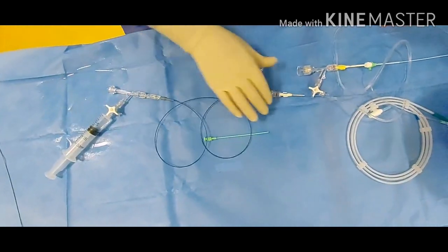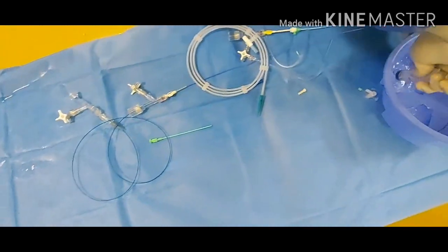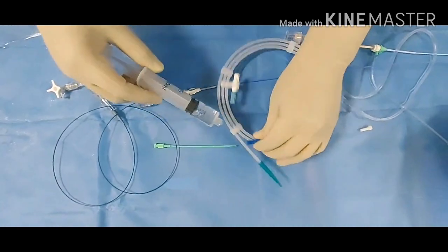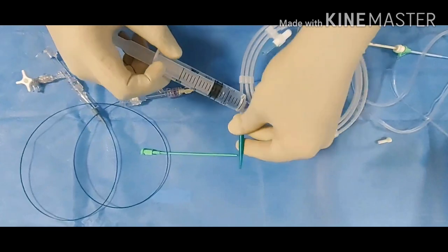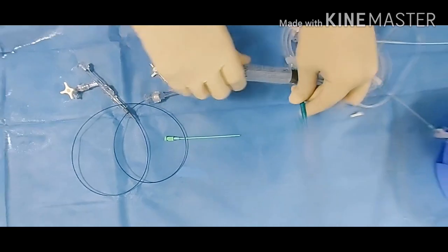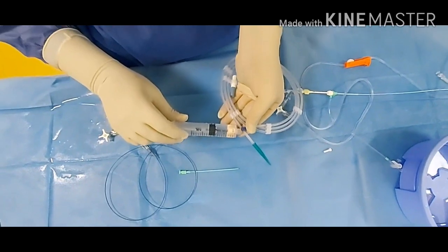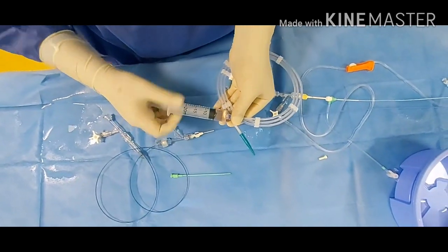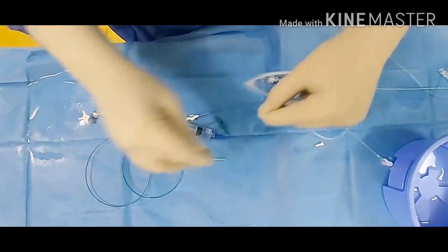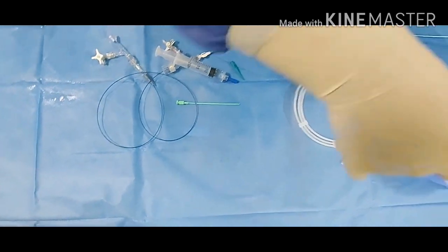One more thing: how to prepare the hydrophilic wire. This is the guiding wire. You need to flush the casing very slowly. Hydrophilic means water-loving. Once it is flushed, now it is ready to go. Hold it in just two loops and give it to the doctor like this.